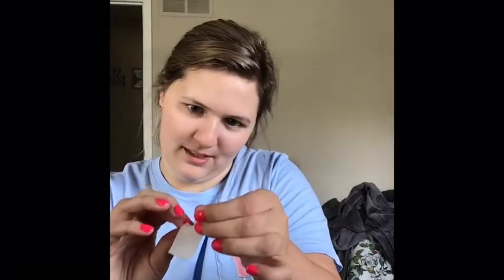Okay, so I know this would probably need to be longer. Obviously, it should be 3 inches. I don't think this is 3 inches. But I'm going to undo it and undo some little legs, so like this. And then I'm just going to put that on my bedside table. So I have 3 total.